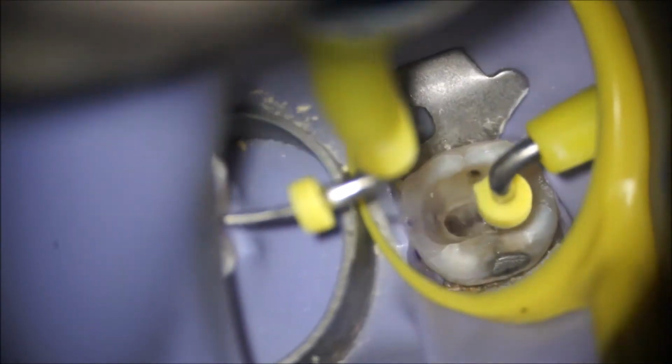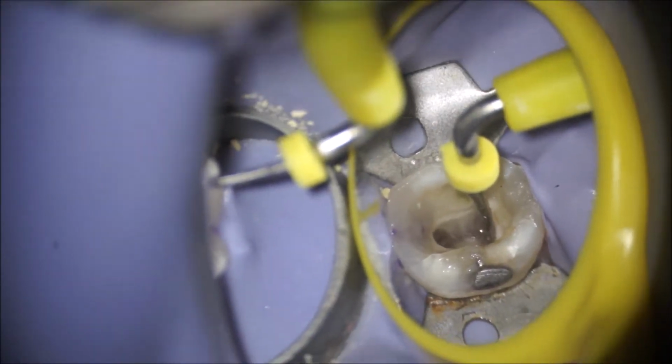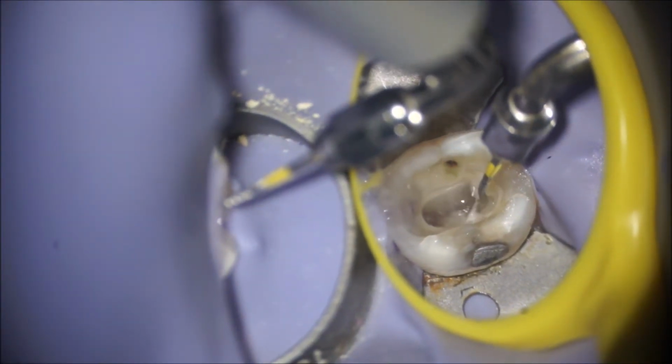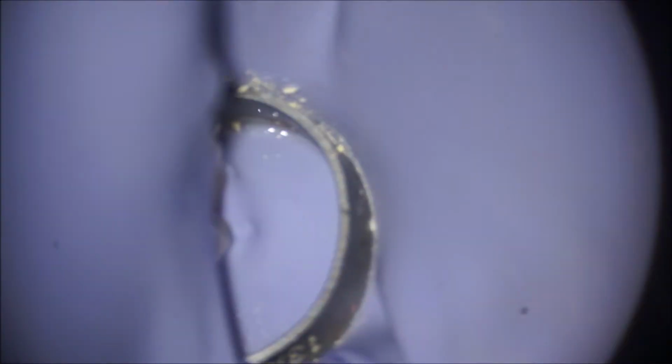Something I've come across was a wireless vertical obturator, but it's one of the cheaper ones, so it's never quite hot enough to burn the GP off. But now we use it to heat the sodium hypochlorite inside the tooth. I think this works better than doing it extraorally. Circulating it through a thin cannula or a needle cools it down again. So if you want to heat your solution, you may try this. I think it works very well.